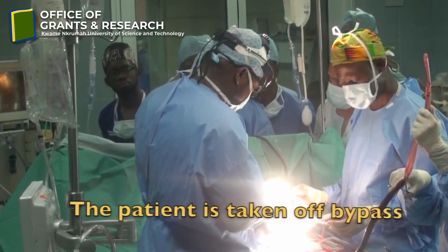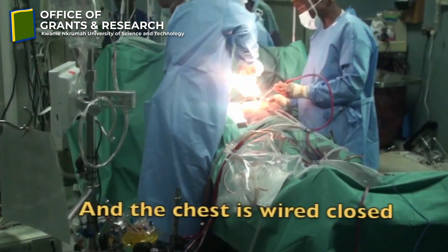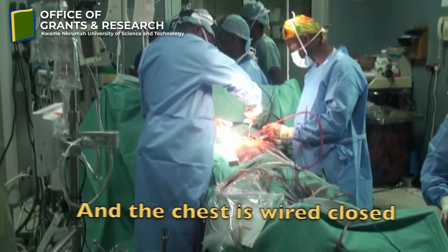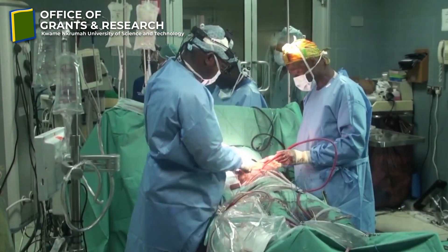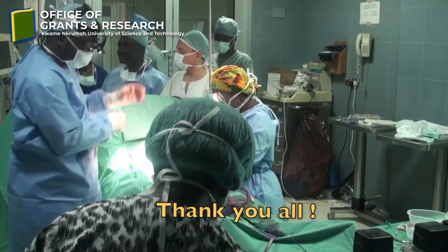We used this special tissue valve because it can stay for long, and the patient does not need to be on the blood thinner drug called warfarin — that is the major advantage. We implanted it and it went so well. We have been following this patient for the past three years and he is doing very well. We realized we were fortunate to be the first people in Africa to implant this special valve, and we have gone ahead to publish our experience of this first implantation of the Resilia valve in Africa.